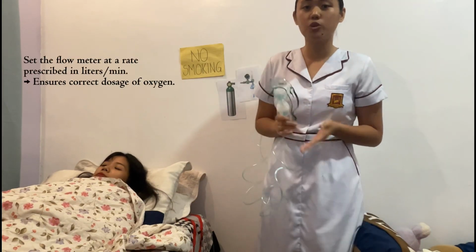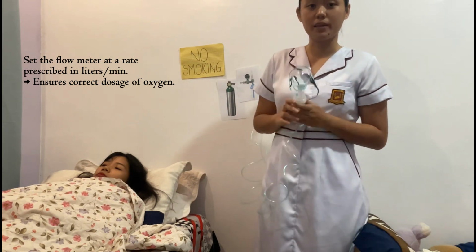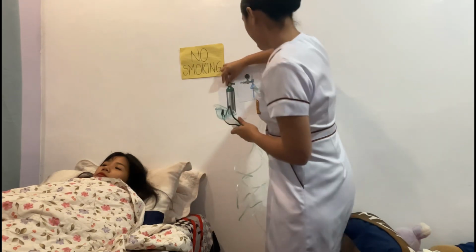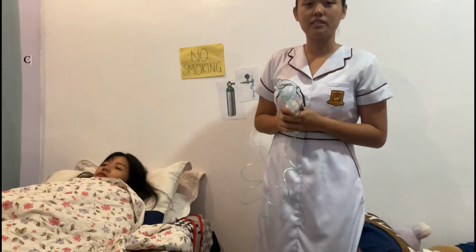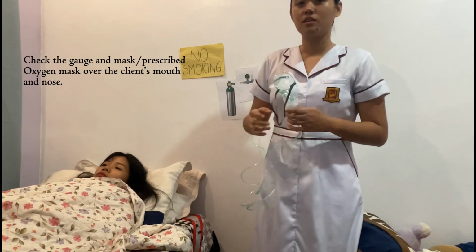Going to set the flow meter at the rate prescribed in liters per minute. So this ensures correct dosage of oxygen. And then check the gauge and place the oxygen mask over the client's mouth and nose.